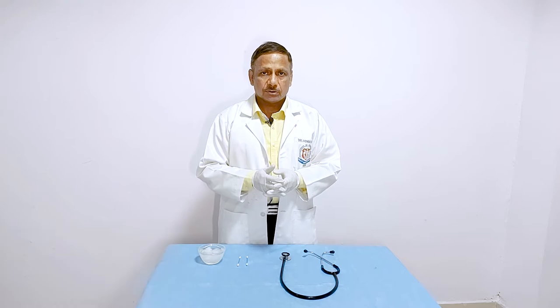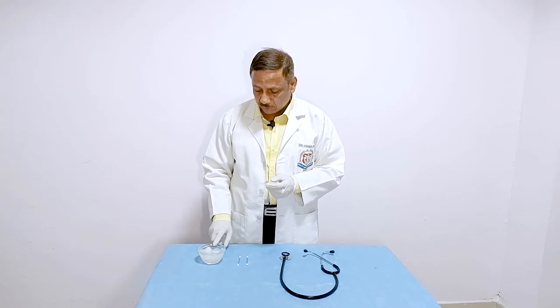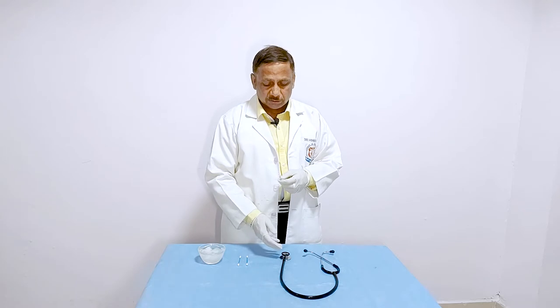Cleaning of stethoscope is very important for all healthcare workers. For cleaning of stethoscope you need to have 70% isopropyl alcohol, earbuds, and of course the stethoscope.